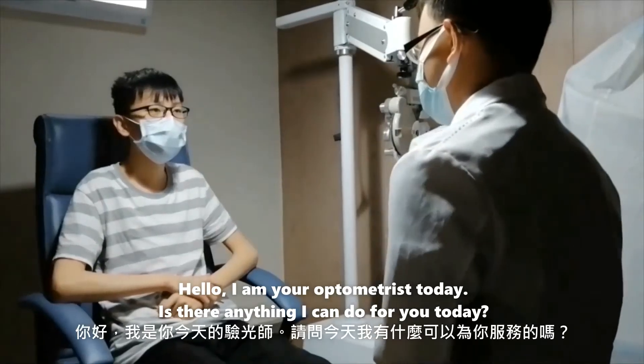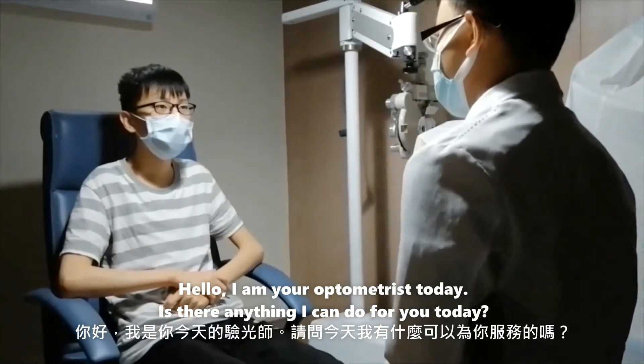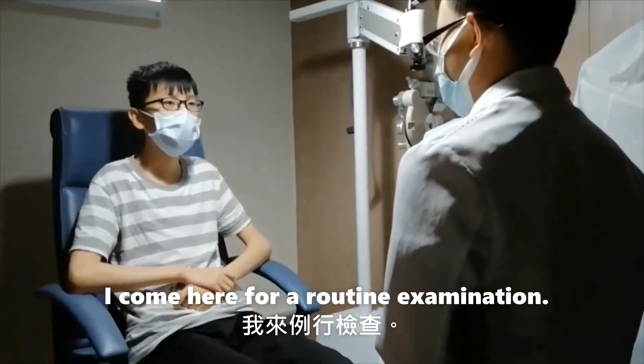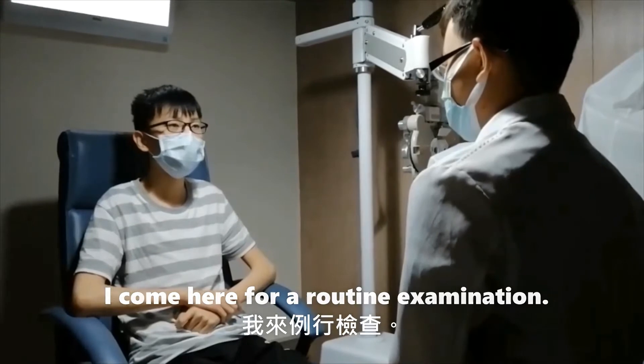Hello, I'm your optometrist today. Is there anything I can do for you today? I come here for a routine examination.